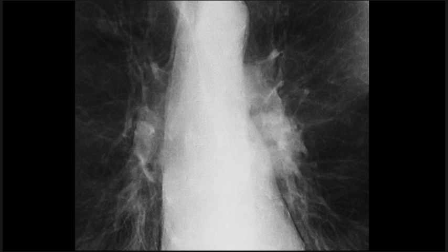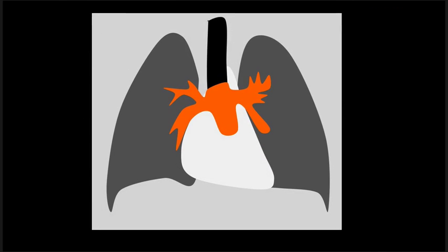Let's turn this into a cartoon. So remember those pulmonary vessels, I said, those are soft tissue density, right? So if we have a tumor that's also soft tissue density, and it's touching, we're going to lose that interface. Well, but if it's not touching, if it's either in front or behind, then we're going to have that interface.